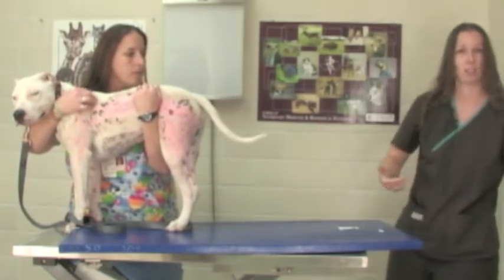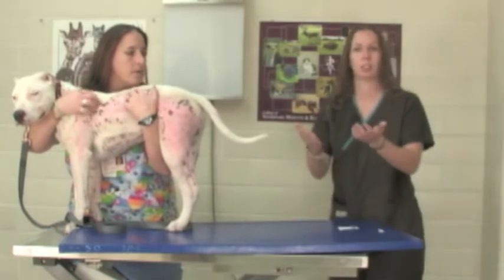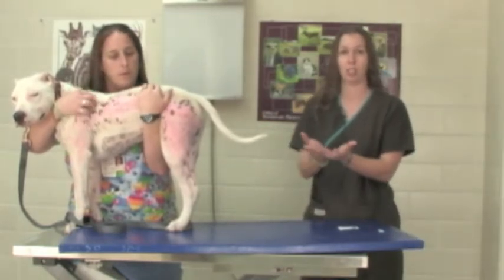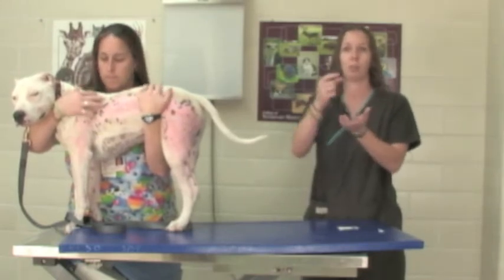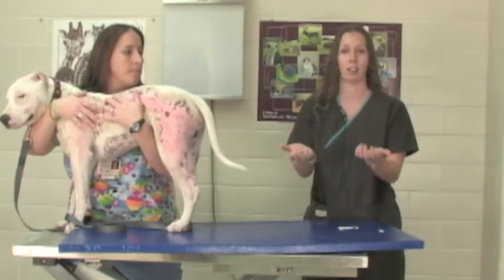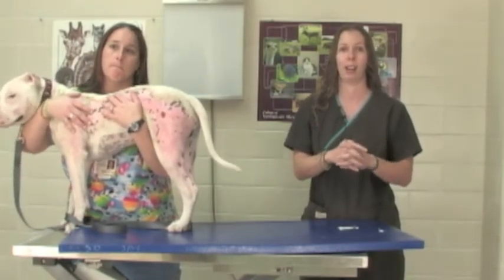We let that sit for 10 minutes, and as it sits, that flotation solution will allow the eggs of all the intestinal parasites — if your patient does have any — to rise to the top and attach themselves to that slide. You can then place that cover slip onto a slide, look at it under a microscope, and identify any intestinal parasites that your patient might have.